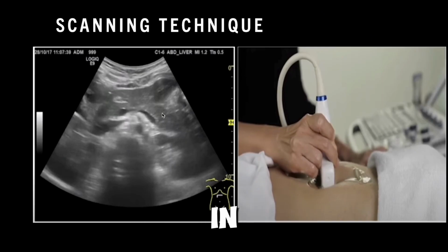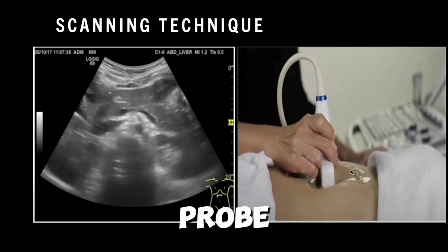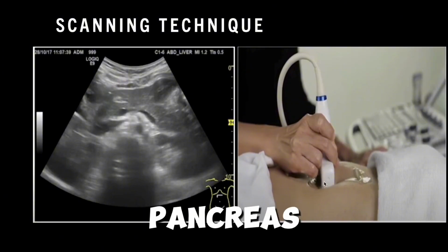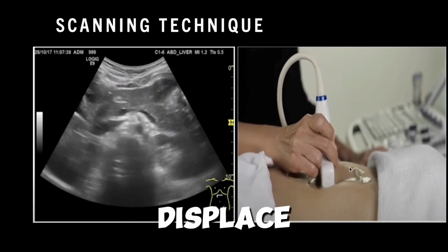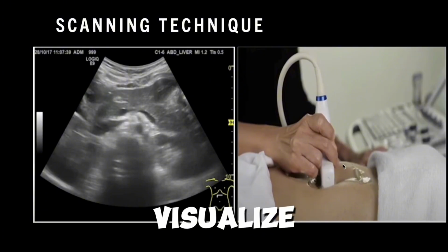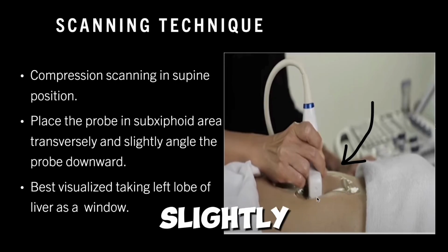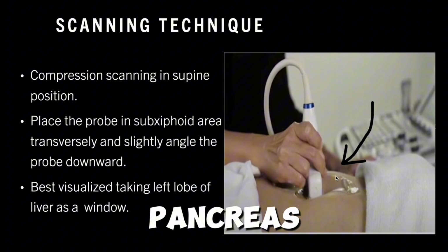Just keep the patient in supine position. Put your probe just below the xiphoid process. Slightly bend the probe downward and slightly scroll the probe downward. You can see the pancreas. On slight compression, you displace large bowel gas and other structures that lie near the pancreas, and you can actually visualize the pancreas. It is quite simple. Keep your patient in supine position, place your probe just below the xiphoid process, slightly compress and slightly move downward. Then you can see the pancreas.